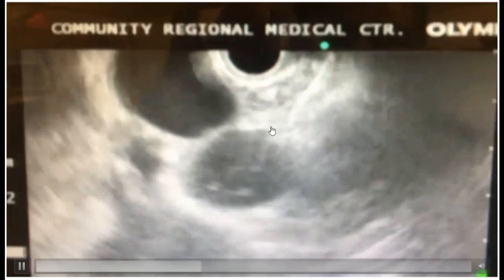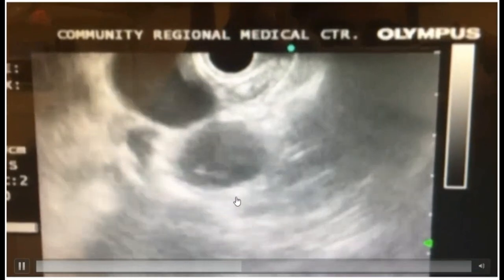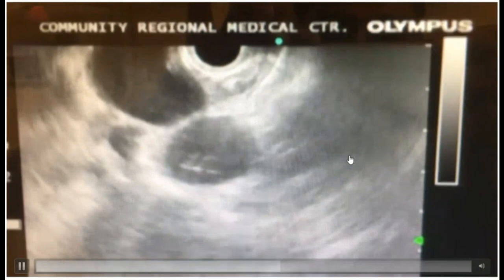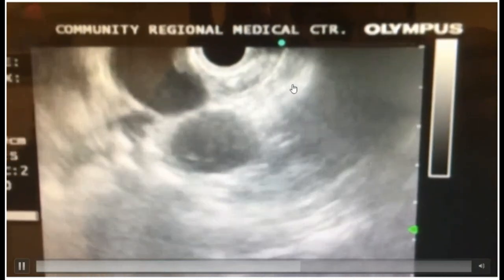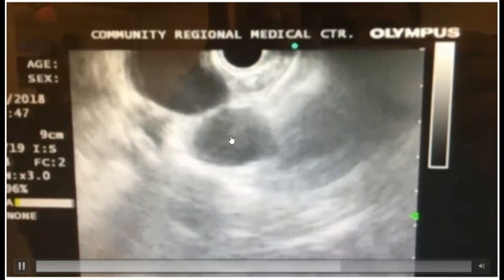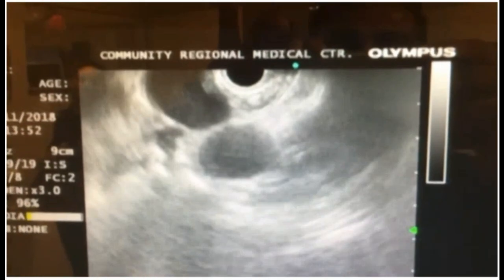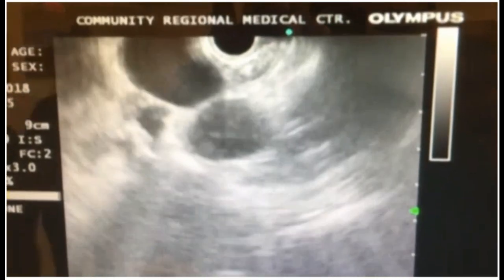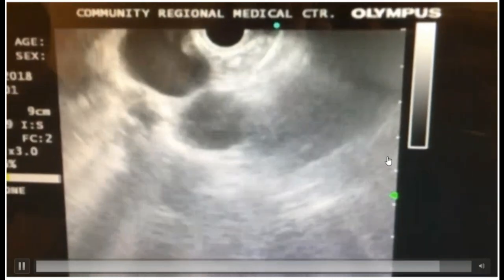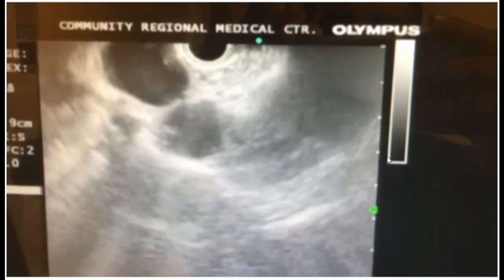The aorto-pulmonary ligament here separates 4L from 5, and we're going after station 5. Using the elevator, without traversing the aorta, we found a window in between the PA and aorta, and then we are accessing station 5 from this window here from the esophagus. This turned out to be a large cell neuroendocrine cancer in this particular patient who had an isolated station 5 lymph node.